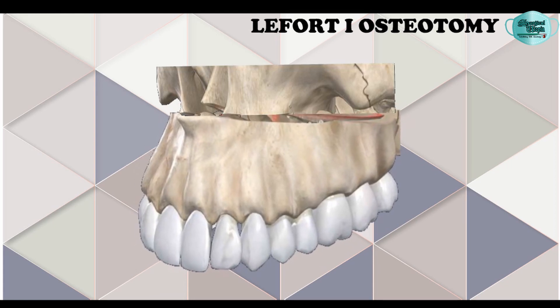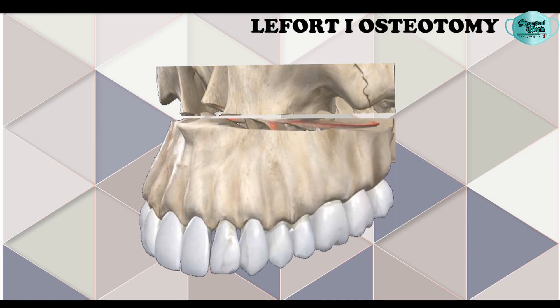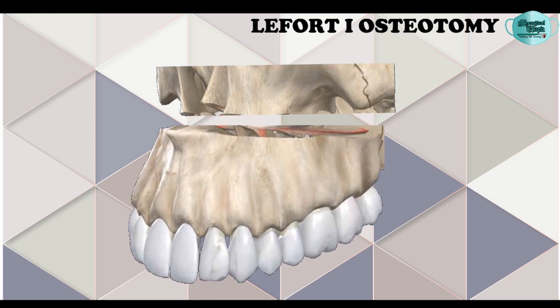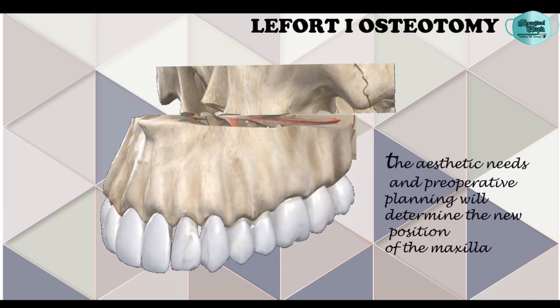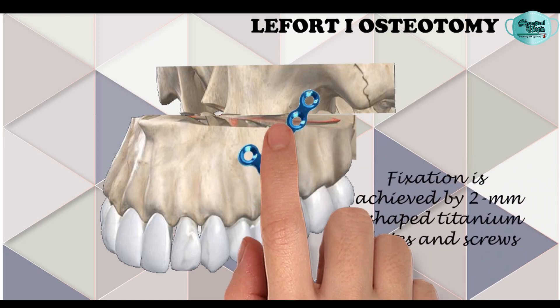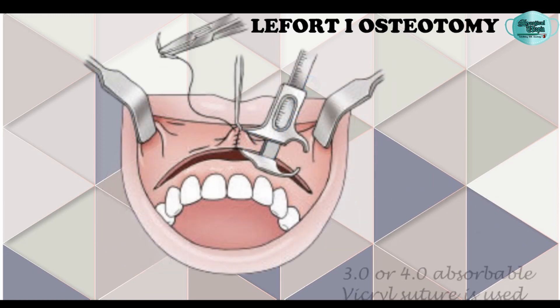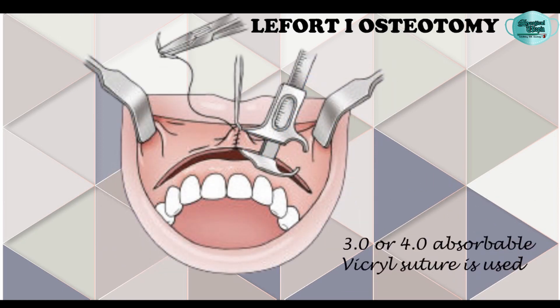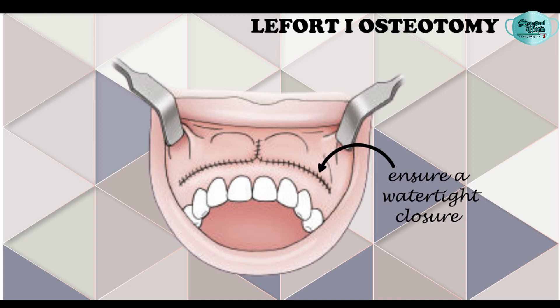After the downward fracture, the maxilla is free and soft tissues are stretched to allow a greater range of motion. The maxilla is then repositioned in the pre-operatively planned position and fixed with 2 mm L-shaped titanium plates and screws, one on each side of the maxillary buttress for stability. The mucosa is then closed and sutured with 3-0 or 4-0 absorbable Vicryl suture to achieve watertight closure.